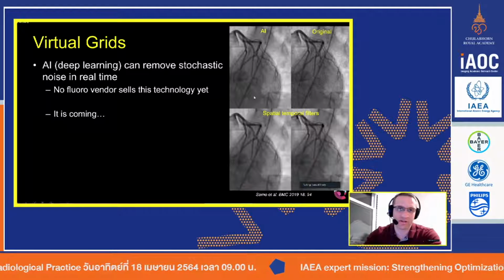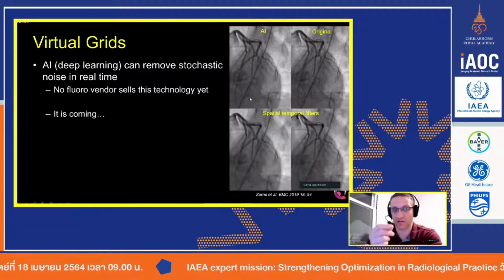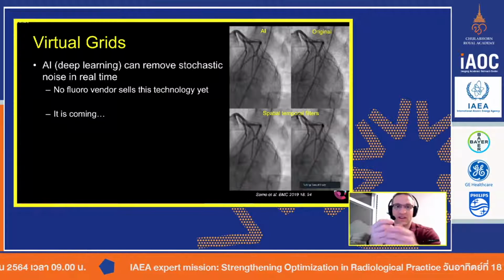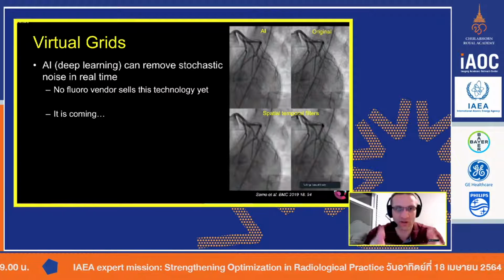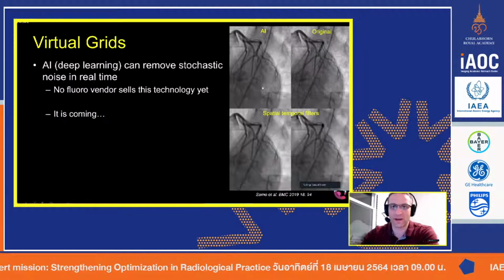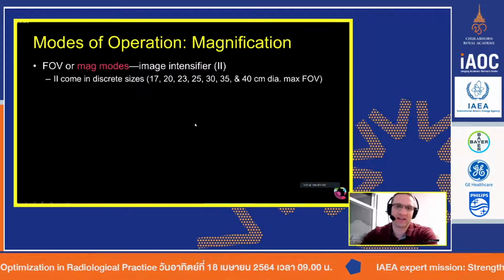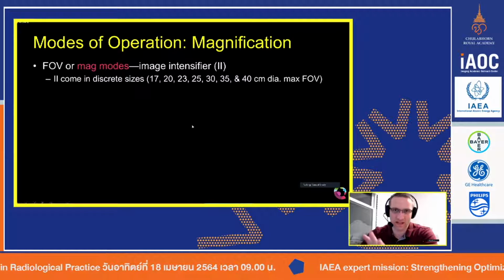But we're starting to find in other areas where you have subtle physiological, pathological effects going on, the image itself is not necessarily a normal image. AI has a little ways to go. But like I said, it's an open area that's still being scientifically looked at.